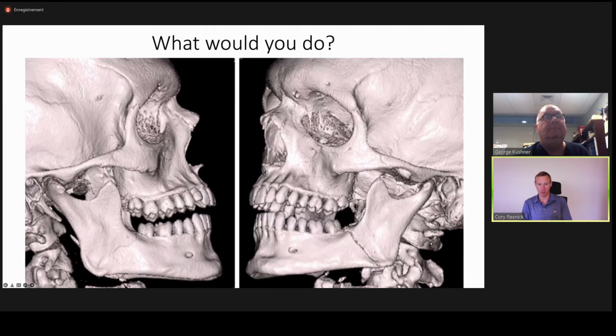Now that may be harder to maintain postoperatively because if they're deep in the vestibules, then soft tissue tends to grow over the screws and such. So they're not really maintainable in those depths for the longer term. But if I'm using them just for half an hour of fracture reduction, then I often try to just stay away from where the roots might be altogether.